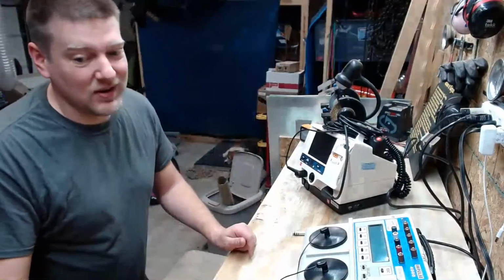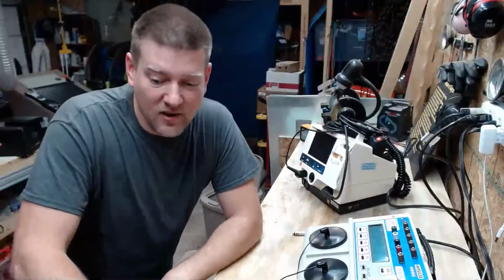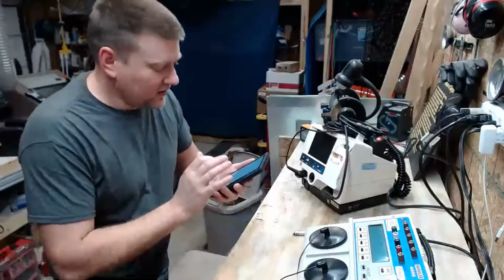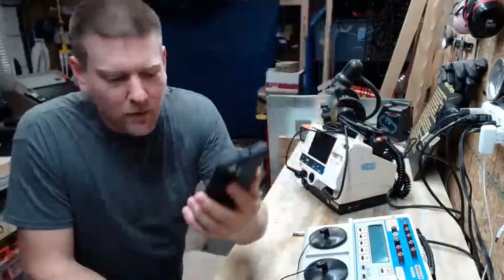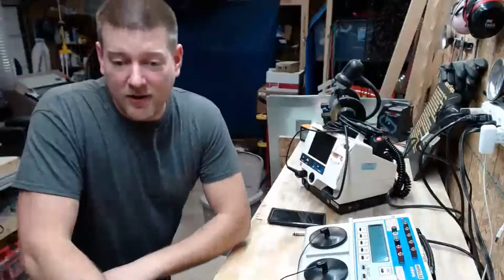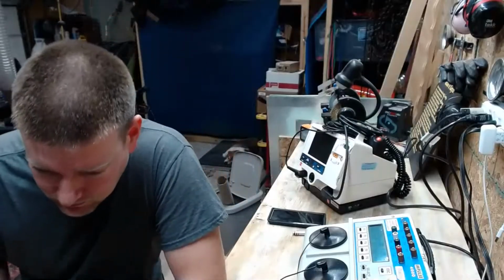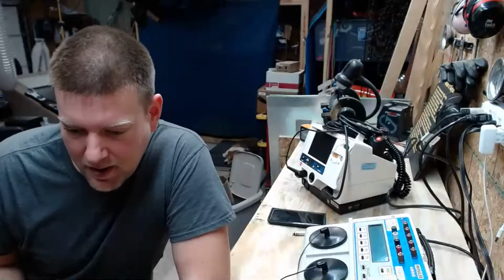My campus is huge, and by doing rounds, I can find stuff like that and try to solve those problems. But at the same time, I'm taking photos. My phone is full of photos, y'all. My phone is full of photos of stuff that I found, stuff that's broke, stuff that's expired, all sorts of stuff. I'm snapping photos and documenting it as I go through my hospital. So it's not paranoia. It's just you being a better technician.